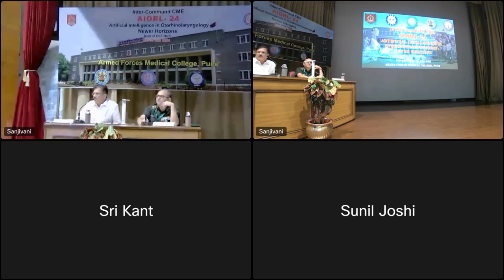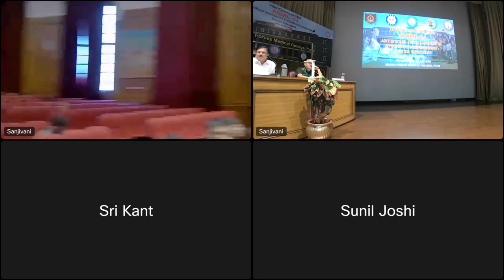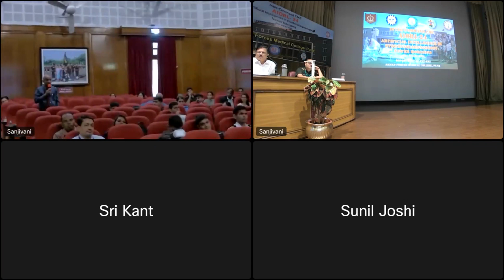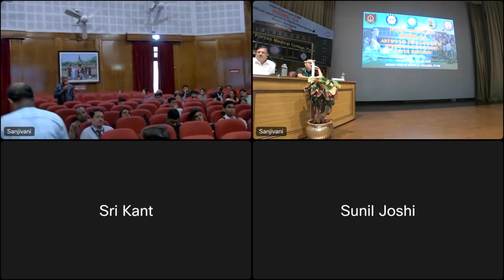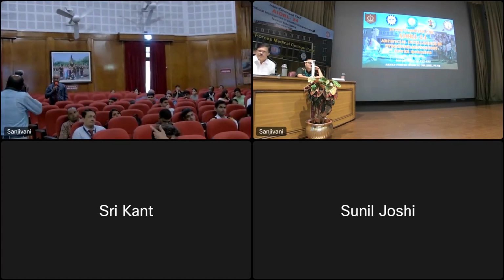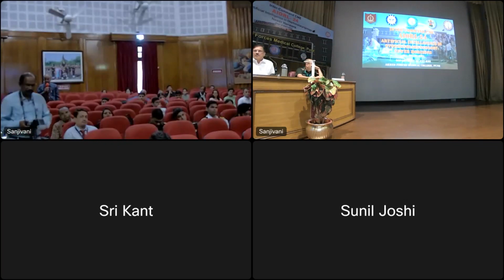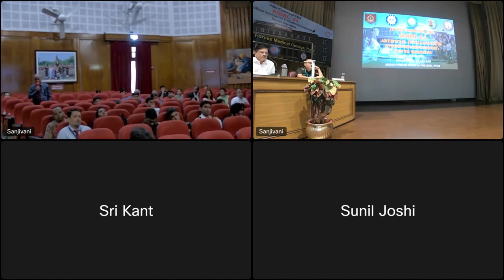This is a slightly different question. We saw some amazing images of the synchrotron. What are we going to do with it in future? I don't know whether you'll be answering that. Is it going to be the imaging modality for CI? Is it going to be a predictive tool looking at the number of neural elements present in the cochlea? Probably, because it's only done in cadavers and can't be done in live human beings, it's going to be used a lot for research to understand more about the surviving neural structures and all of that. Yes, sir.